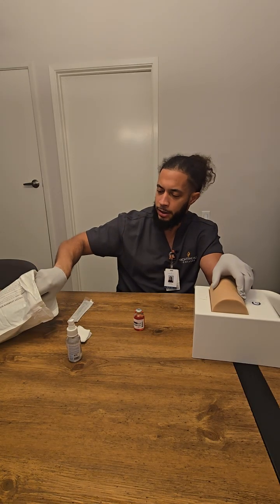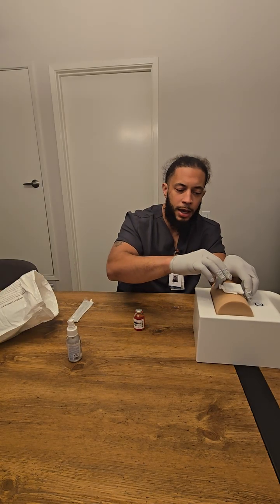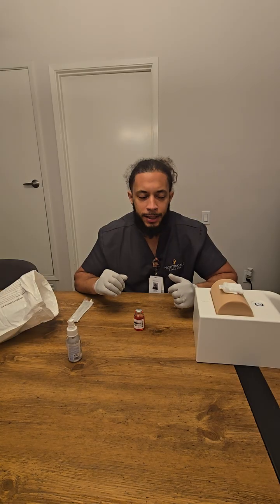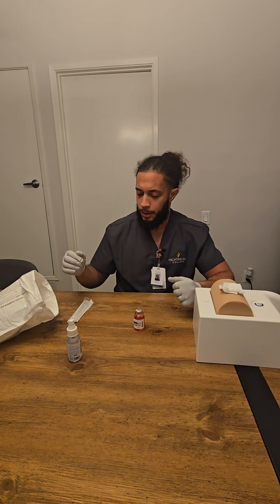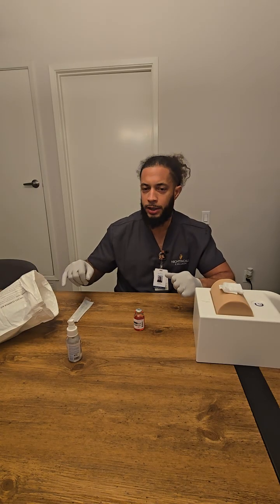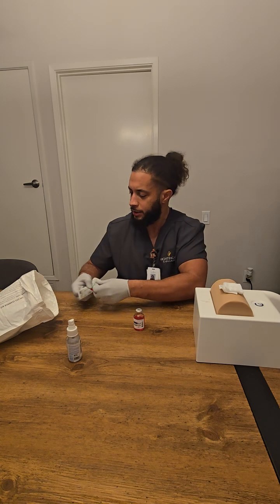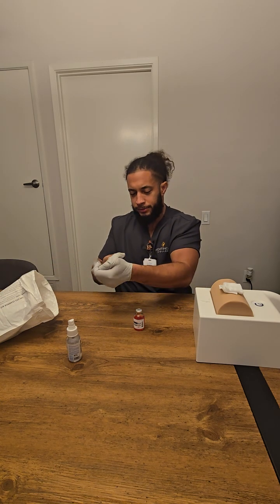We discard the needle. We put our gauze and keep it there. If it keeps bleeding, we just let it air dry. In the meantime, I discarded my needle. I can pick up all my stuff, get rid of my trash, and remove my gloves.